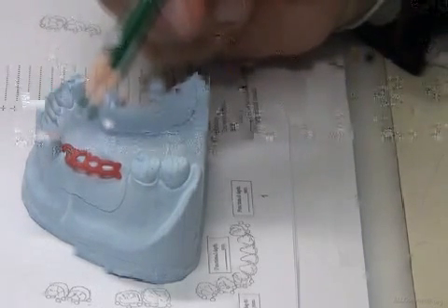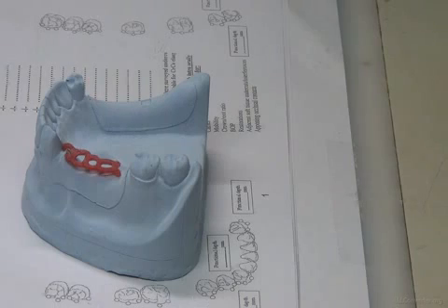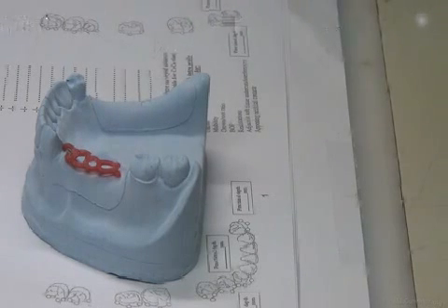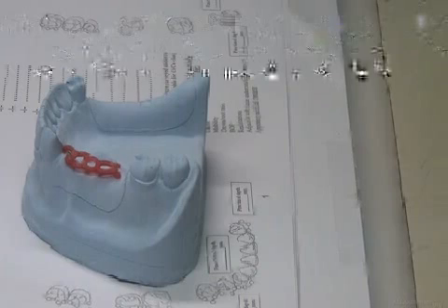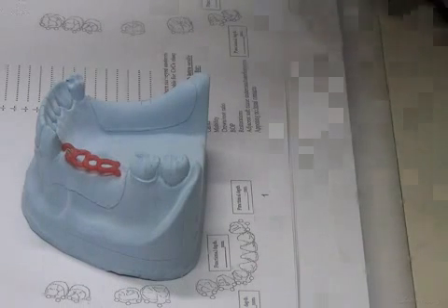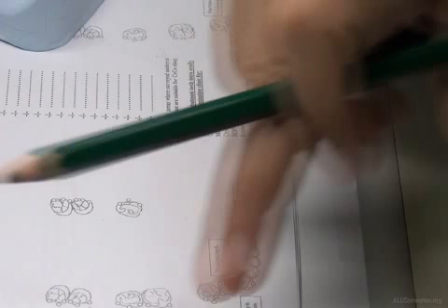So if I have a case where I have limited interocclusal space, for example, over erupted teeth, I need to change to a mesh. Okay? But let us keep with the basic design with no rules. Notice that here there are no rules written, meaning everything is suitable.